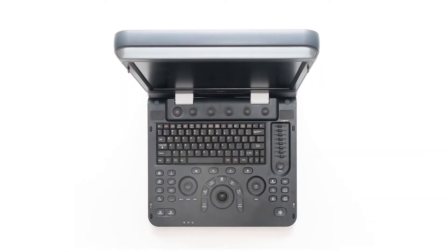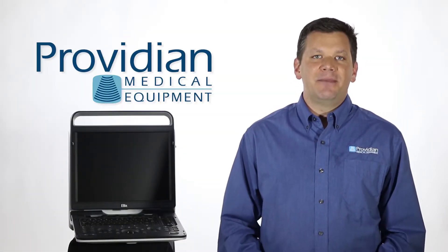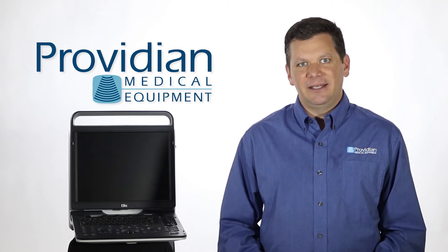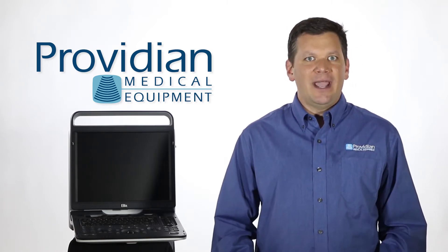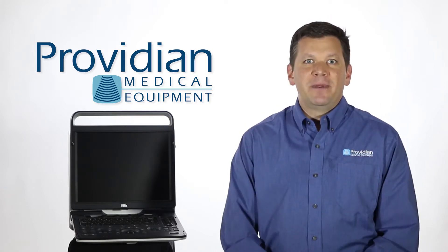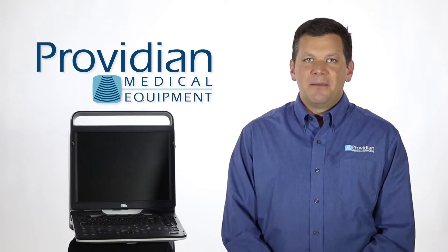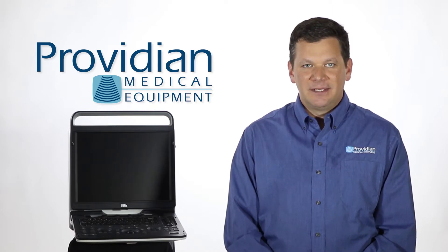Until now, to get a good portable shared service machine with good cardiac imaging, you had to make some sacrifices and compromises. If your budget was tight, you had to sacrifice image quality, usability, and features, or had to purchase an older refurbished ultrasound machine. There have been many attempts in recent years to make an affordable shared service machine, but nothing met the perfect combination of price and performance.